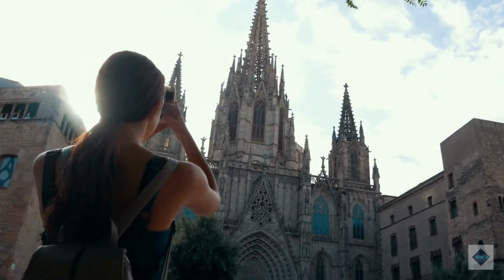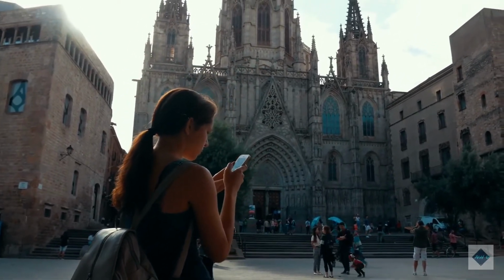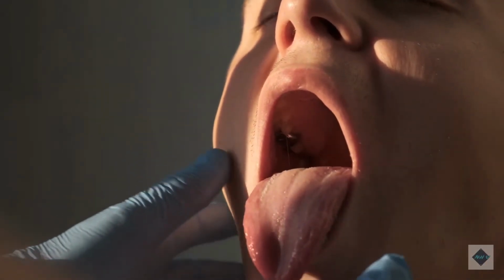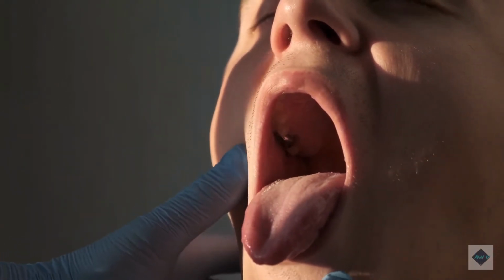Wang's team augmented the smartphone camera's capabilities by attaching a small 3D printed ring containing 10 LED black lights around a smartphone case's camera opening. The researchers used the LED-augmented smartphone to take images of the oral cavity and skin on the face of 2 research subjects. The LED lights excite a class of bacteria-derived molecules called porphyrins, causing them to emit a red fluorescent signal that the smartphone camera can then pick up, said lead author Qinghua He, a UW doctoral student in bioengineering.